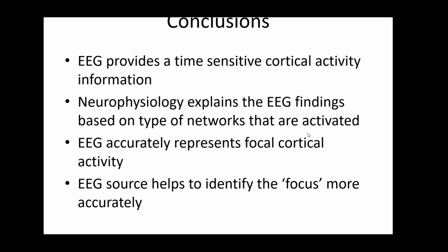All right, we had one more, and if anyone else has any other questions, feel free to type those into the question box. This question was, do you have any time frequency findings underpinning the corticothalamic models that you discussed? Are there some types of frequency band responses that can help to understand these types of connections? Like, is the communication primarily happening in the theta range or the gamma range or another frequency band?